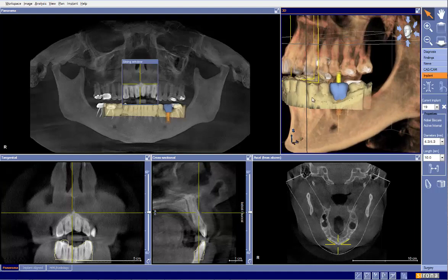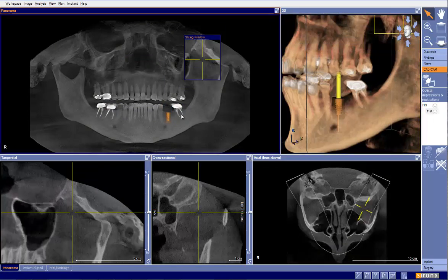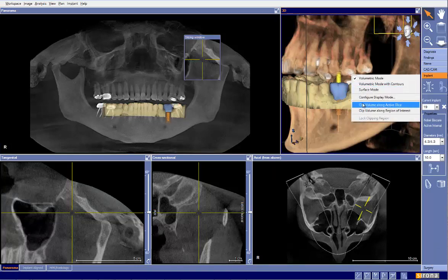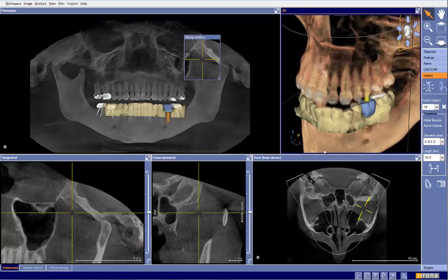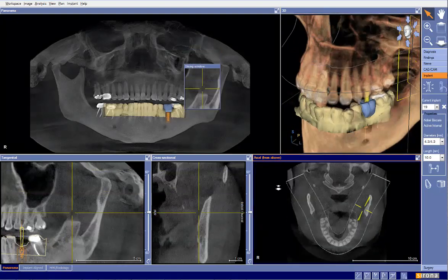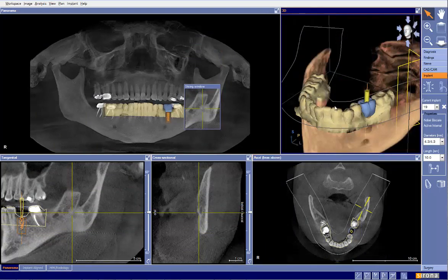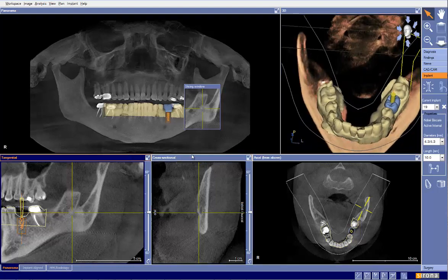In cases like this, the first thing I like to do when I have full arterseric data — which is great — is that this is going to be an OptiGuide case. We've got plenty of natural teeth. We can't use tooth numbers 18, 30, or 31 for our integration, but we have all the other data that we need. I like to go ahead and clip along the active slice on the axial view, and then click to lock the clipping region so it's always on the axial no matter what window I click.